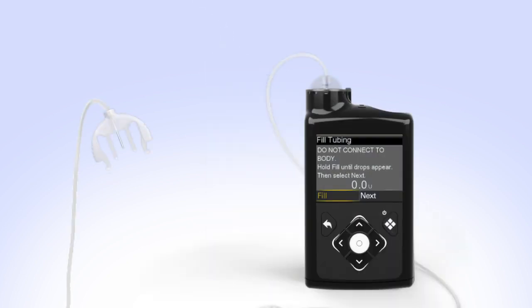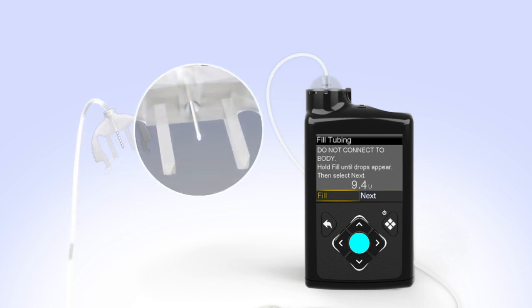Hold the set so that the needle is pointing down. With Fill highlighted on the screen, press and hold Select. The pump screen will display the amount of insulin being moved through the tubing. Continue to hold Select until you see insulin drops coming out at the end of the needle. After you see the drops, release the Select button.